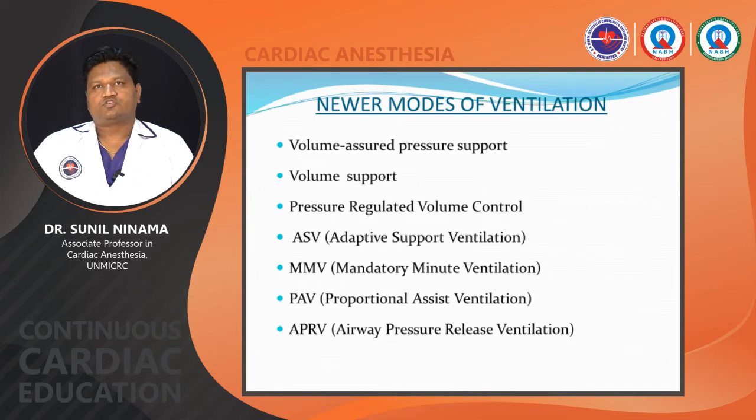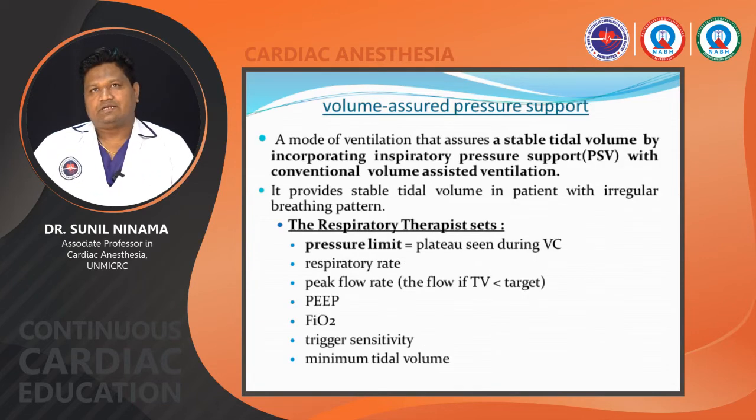Now there are newer modes of ventilators. There are volume assured pressure support, volume support ventilation, pressure regulated volume control, called PRVC, adaptive support ventilation, called ASV, MMV, mandatory minute ventilation, proportional assist ventilation, and APRV, airway pressure release ventilation. We will go into a little bit of detail on these.